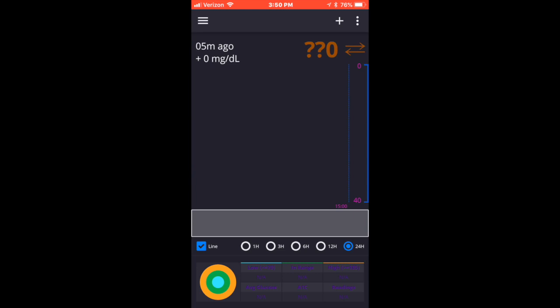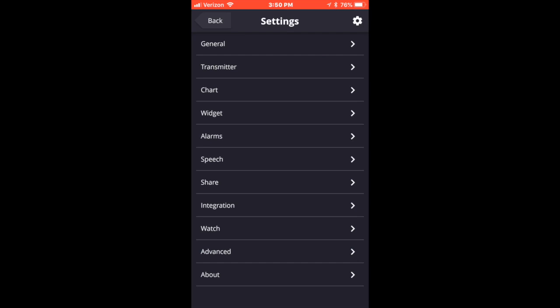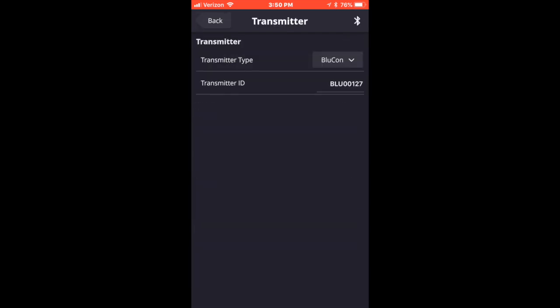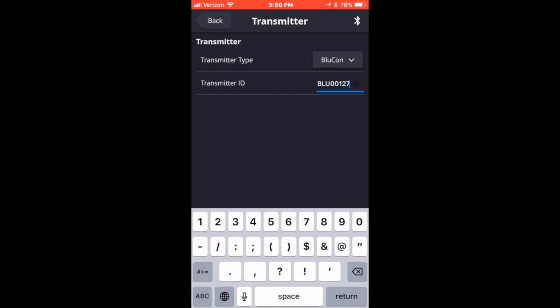Okay, there it goes. You click on that, then go to Settings, go to Transmitter, and then click on BluCon. It's asking for the last five digits of the actual transmitter for your NightRider. You type in BLU in capital letters, then type in those last five digits — so that's what you'll see me doing here momentarily.